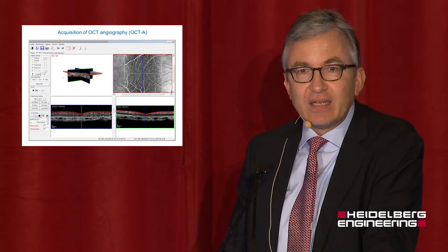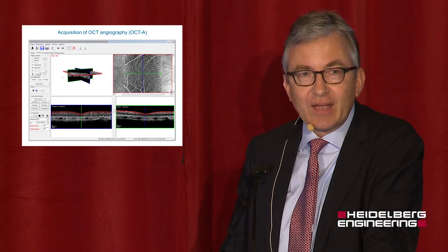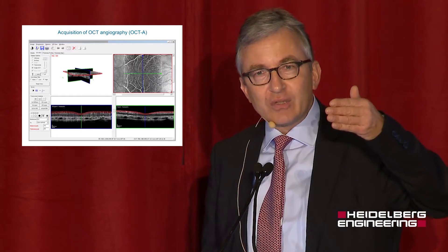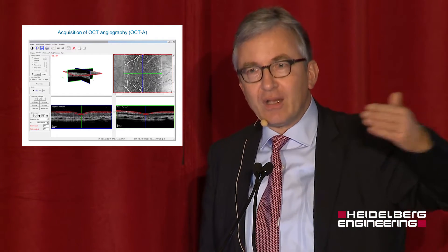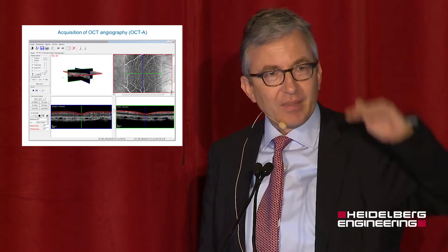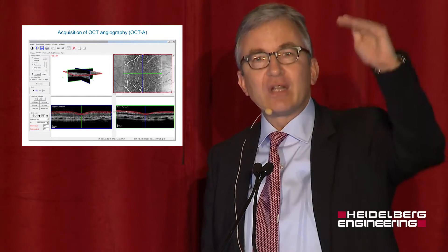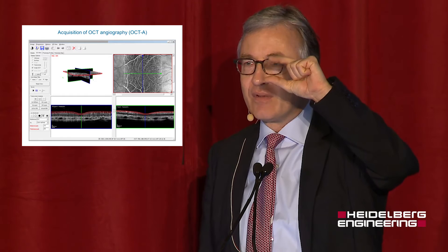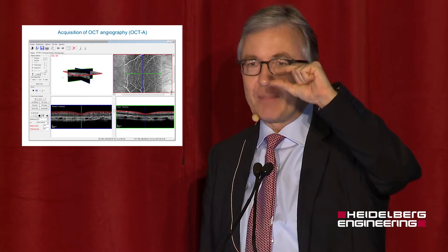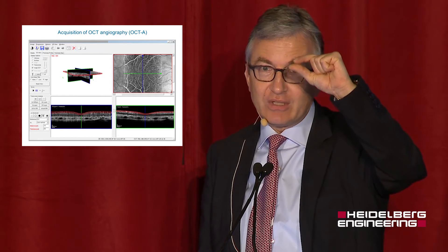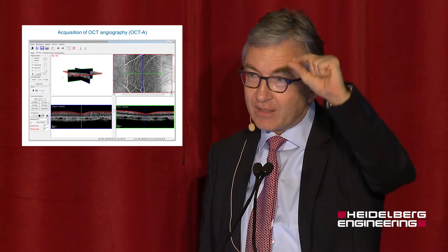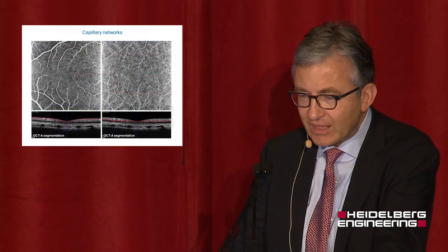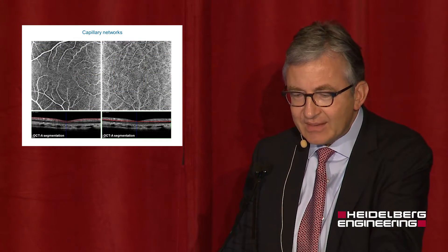Here with the Spectralis instrument, we have learned and seen already beautiful images. We are used in the B-scans to scroll basically horizontally, but now we do the scrolling vertically and can define the vertical dimension of our slab, which gives the opportunity to particularly look at the capillaries in the inner portions of the neurosensory retina.